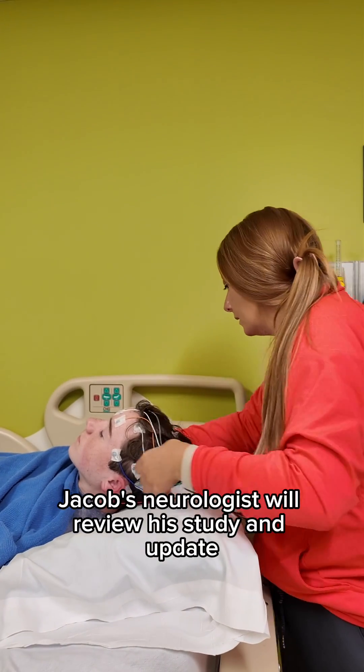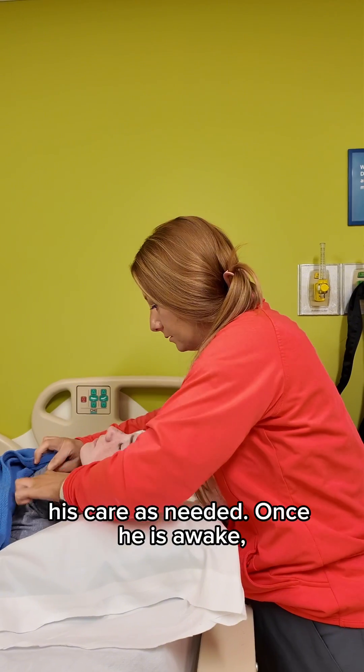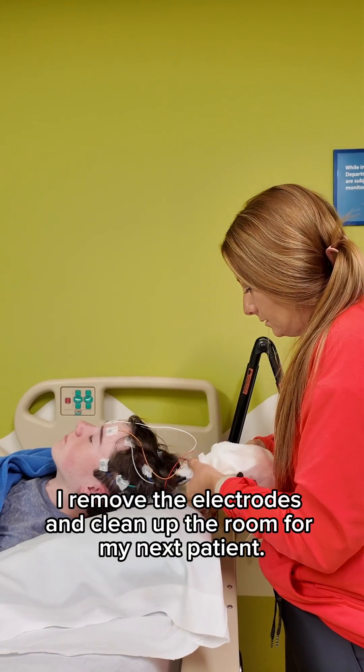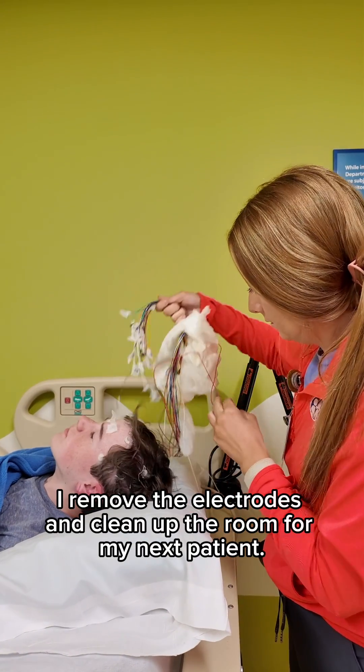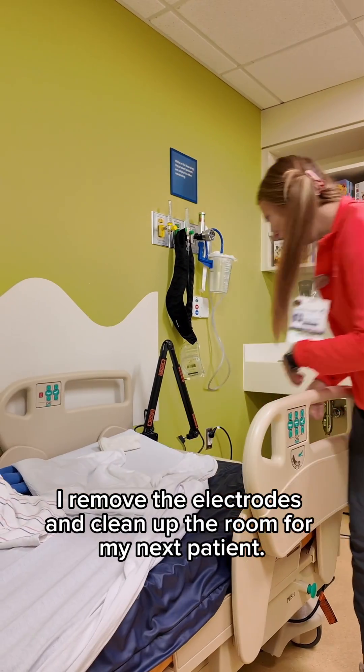Jacob's neurologist will review his study and update his care as needed. Once he is awake, I remove the electrodes and clean up the room for my next patient.